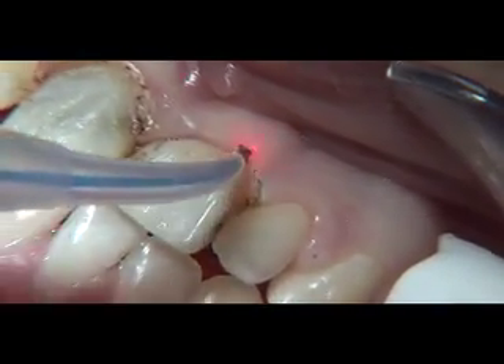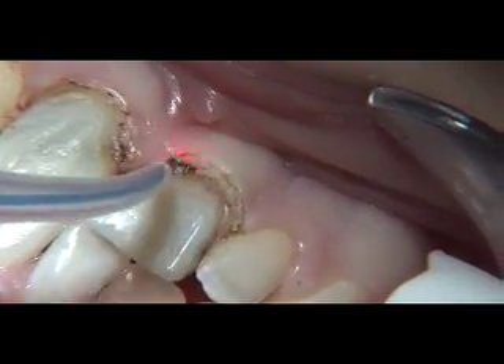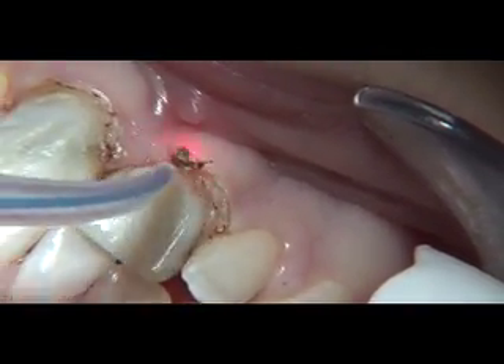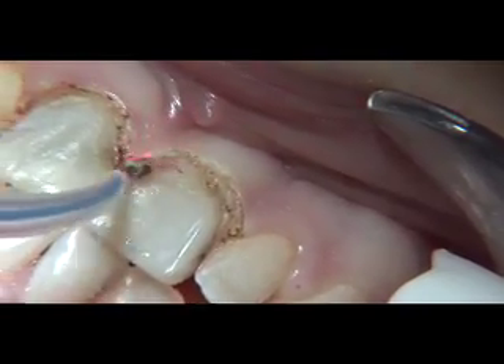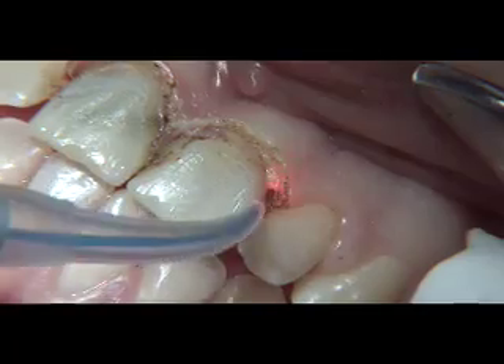As you can see here, 1.4 watts is more than ample to perform this procedure, and this procedure results in very little trauma to the patient. Also note that there is no bleeding associated with the gingivoplasty procedure.